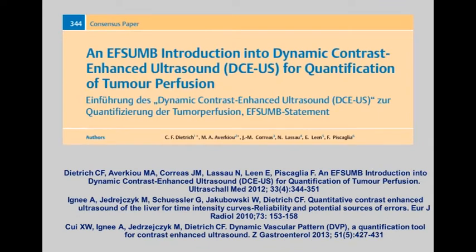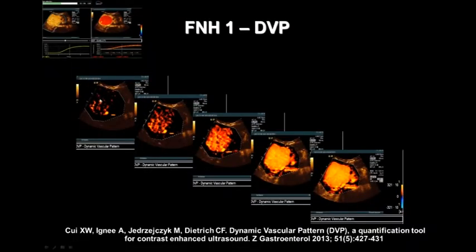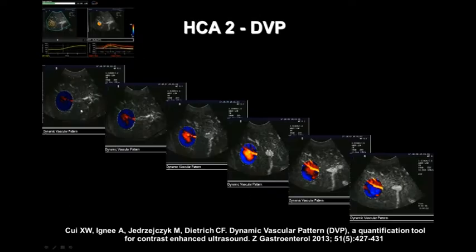Contrast-enhanced ultrasound has also been standardized. That means we have a quantitative way to express the contrast-enhancing features by analyzing time intensity curves, and this has also been summarized in guidelines and recommendations. To give you an example, hyperenhancement during the portal venous phase can be delineated by orange color, as shown here, whereas hyperenhancement in the arterial phase, you can see my arrow, is shown here. And during the portal venous phase, we see here hypoenhancement.